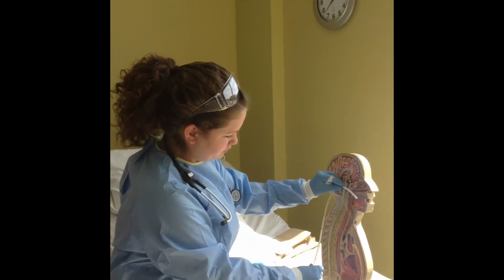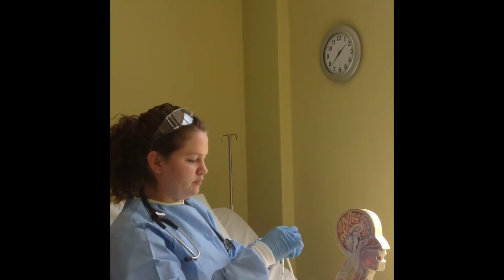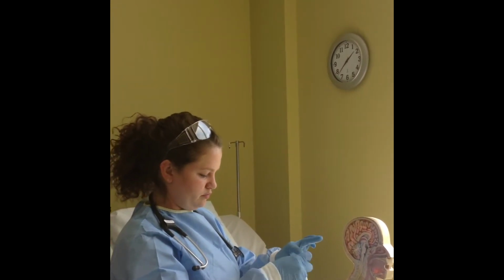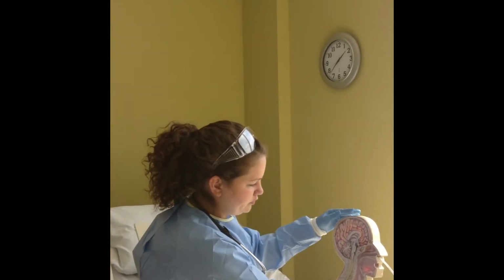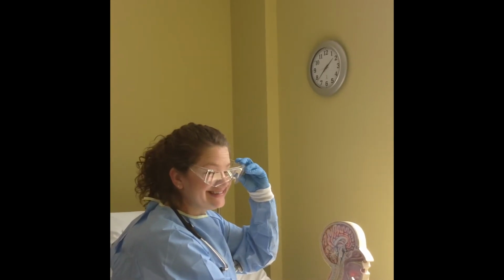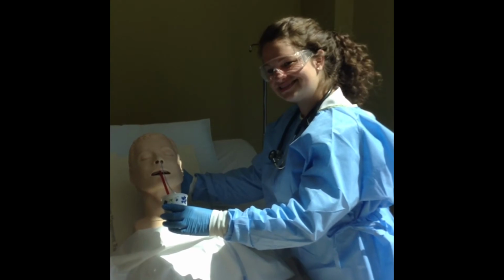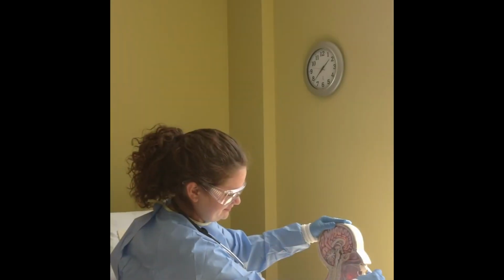Lubricate the first 2 to 3 inches of the tube with lidocaine jelly lubricant, and ensure that the beveled opening of the tube is positioned toward the nasal septum to avoid trauma. Have the patient flex his or her neck towards the chest, and slowly and gently insert the tube into the nostril straight back at a 90-degree angle. Have the patient begin taking small sips of water and swallow as you gently advance the tube.